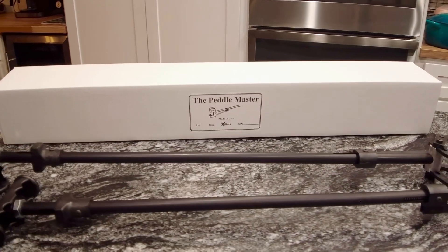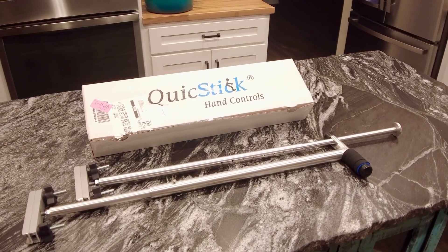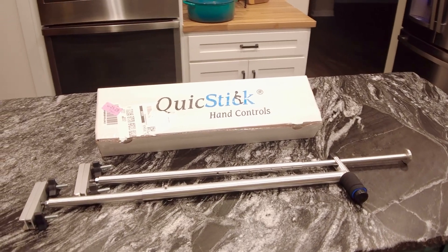The two we're going to check out are the Pedal Master — made by a company right here in Colorado — and the Quick Stick. The Pedal Master has two separate devices, one for your brake and one for your gas. The Quick Stick also has two different controls for gas and brake, however they are combined into a form that keeps them together and allows for one-handed control — your thumb works the accelerator and your hand simply pushes for the brake.